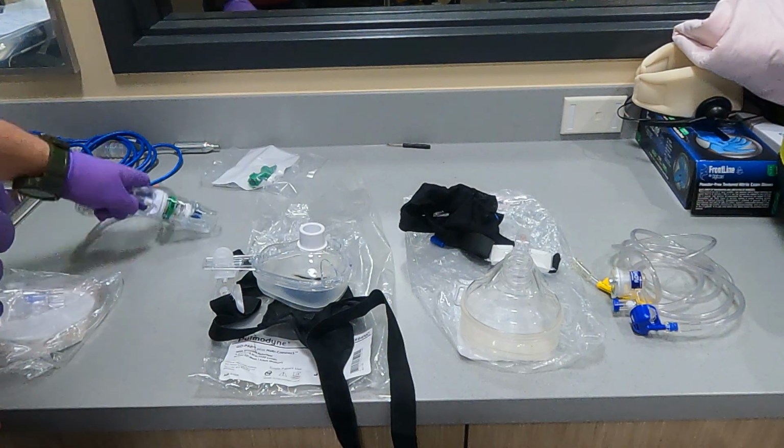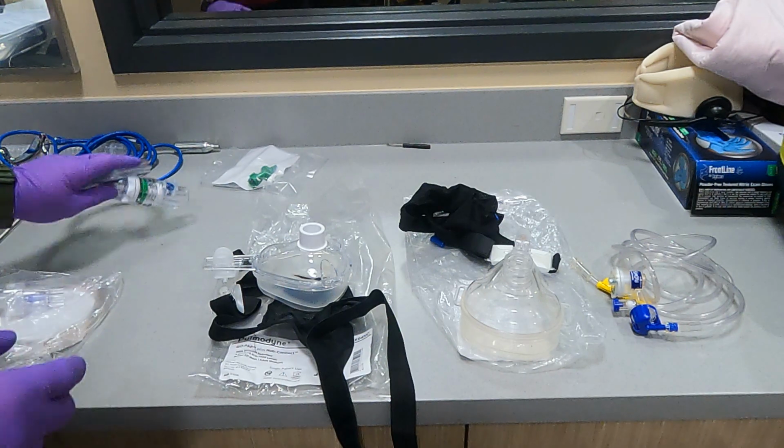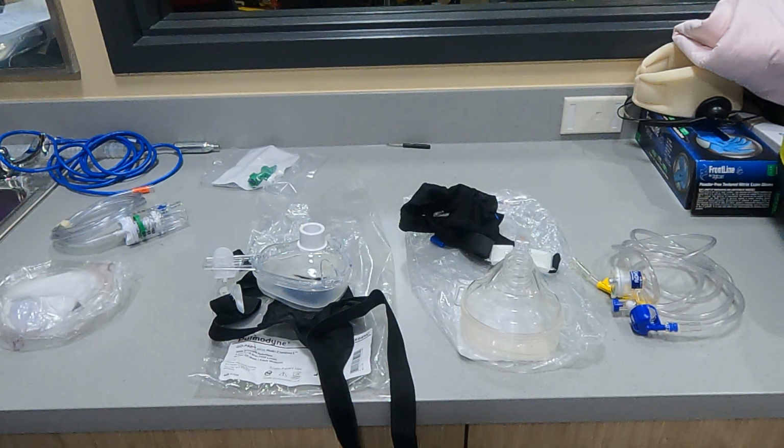The other big difference with the new one is right here is a port that you can attach a nebulizer to. So for your asthma and COPD patients, you can actually give them a nebulized treatment along with the CPAP if your protocols allow it. Our masks do come in several different sizes. There is a small, medium, and then there is a large adult. So make sure you look at your patient's face to figure out which size mask is going to fit them.